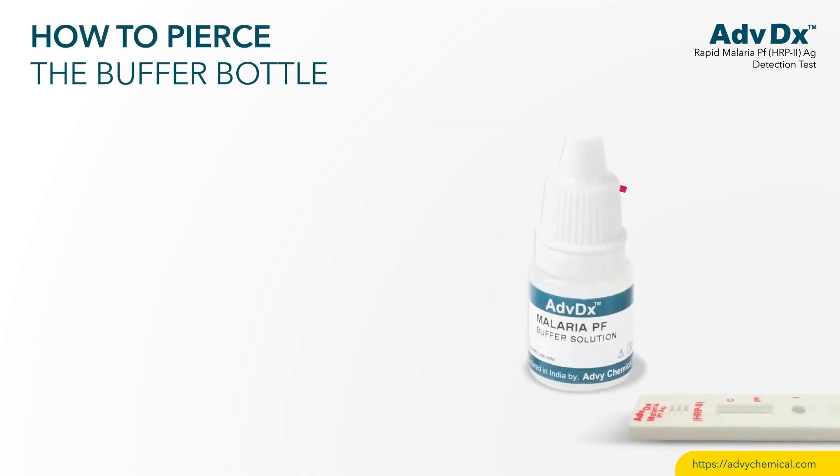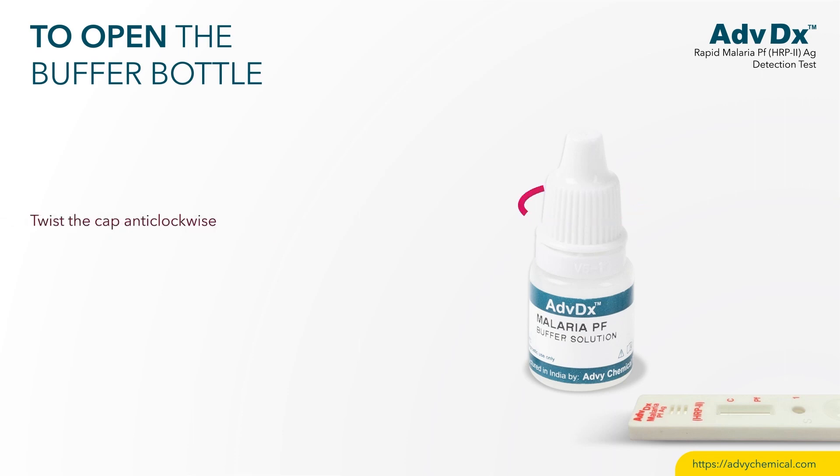How to pierce the buffer bottle: tighten the cap clockwise to pierce the dropper bottle nozzle. To open the buffer bottle, twist the cap anticlockwise.